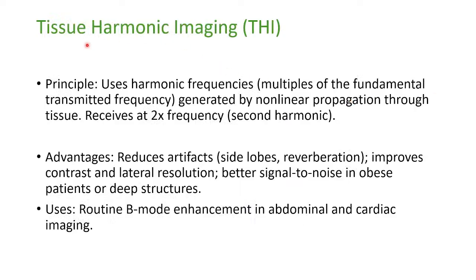We also have what is called tissue harmonic imaging. The principle uses harmonic frequencies, multiples of the fundamental transmitted frequency generated by nonlinear propagation through tissue, received at 2 times the frequency, the second harmonic.